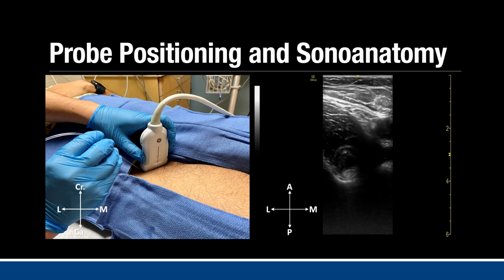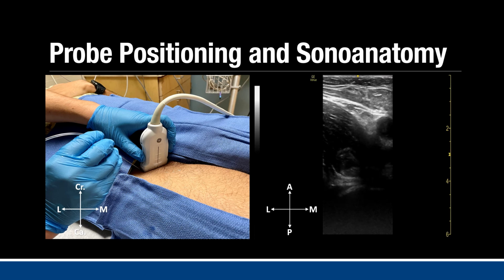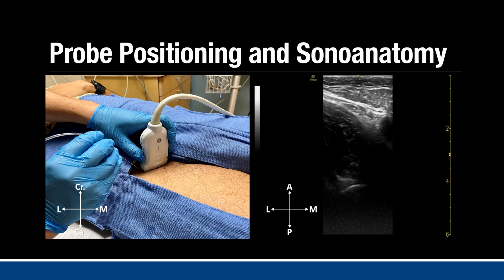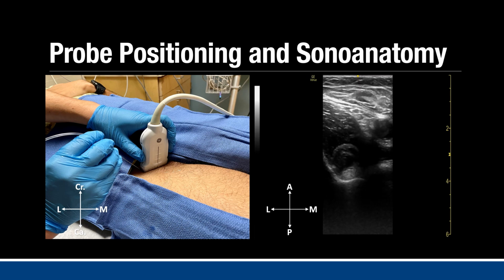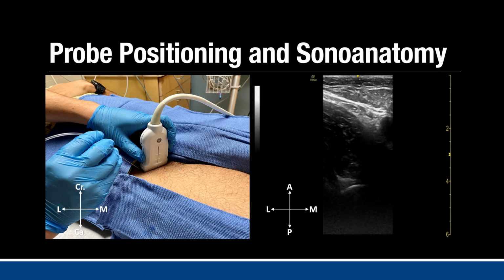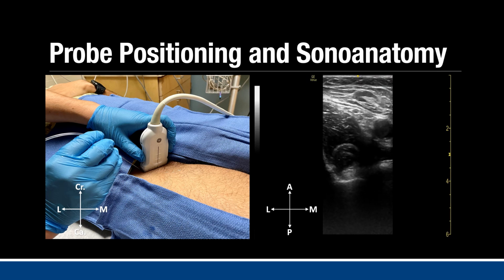The corresponding sonoanatomy clip initially shows the femoral head in the far field with the readily identifiable femoral artery in the medial near field. As the transducer is moved cranially, the iliopubic rim is brought into view as a hyperechoic undulating stripe. One can also see the hypoechoic iliacus muscle with two overlying hyperechoic stripes corresponding to the superficial fascia lata and the deep fascia iliaca.